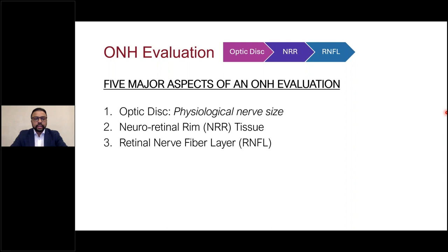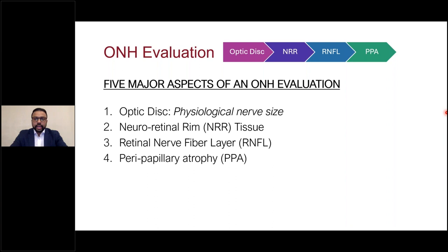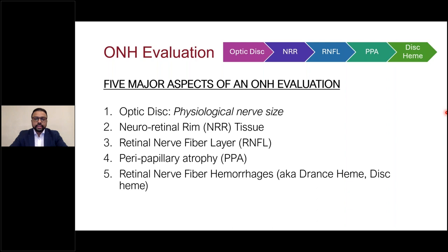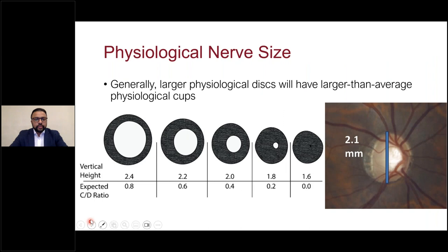Wedge defects look impressive because there's often an associated visual field defect, but the most common type of RNFL loss in glaucoma is actually diffuse. We also want to evaluate the peripapillary area for atrophy — in glaucoma patients, there's often an inverse relationship between loss of neuroretinal rim and an increase in beta zone peripapillary atrophy. And we want to look for the presence of disc hemorrhages.